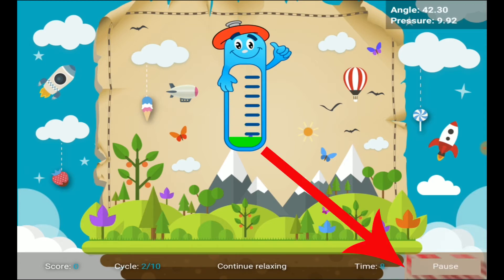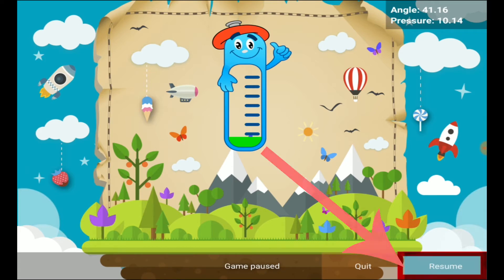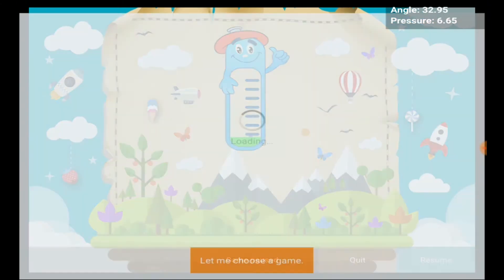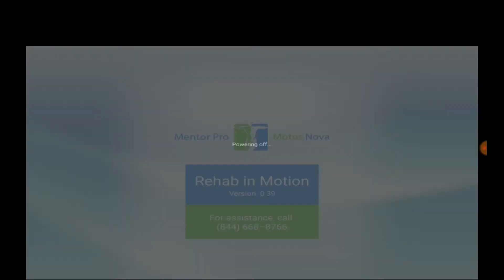If you need to pause the game for a bathroom break or a phone call, hit the pause button on the bottom right of the screen. When you're ready, hit the resume button on the bottom right to pick up where you left off. If you need to stop entirely, hit pause and then the quit button. This will take you back to the game selection screen, where you can hit the power switch in the back, power off the device, and take off the Hand Mentor.